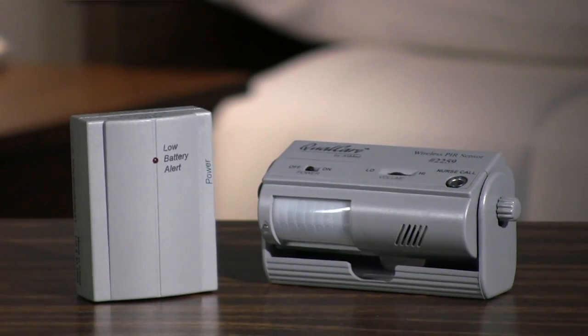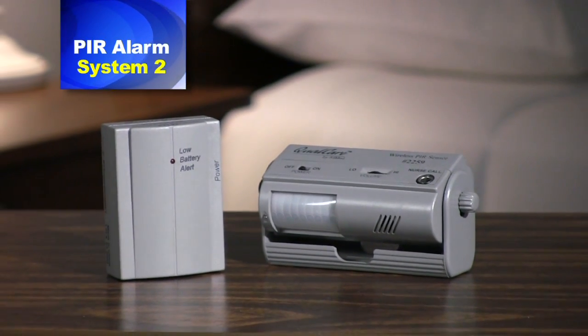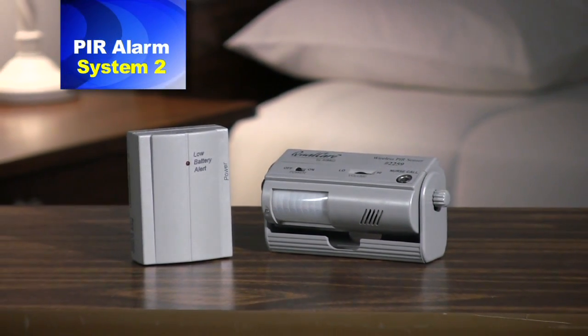Hello, I'm Heidi Young from Alimed, and you are viewing video 2 of the PIR alarm systems featuring System 2, motion detection bed alarm with nurse call receiver. If you have not yet seen our overview, you may want to go back and view that video first to get a general idea of how the whole system works, how to use it, and all its benefits and features.